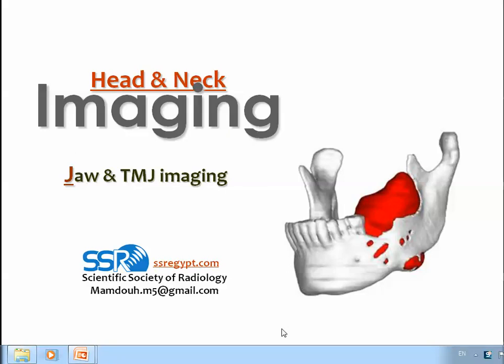Dear colleagues, now in this lecture we are going to continue the series of the head and neck imaging. There are two remaining lectures in this series for the time being. The first one is about the imaging of the mandible and the temporomandibular joint, and the second one is about the imaging of head and neck infections.